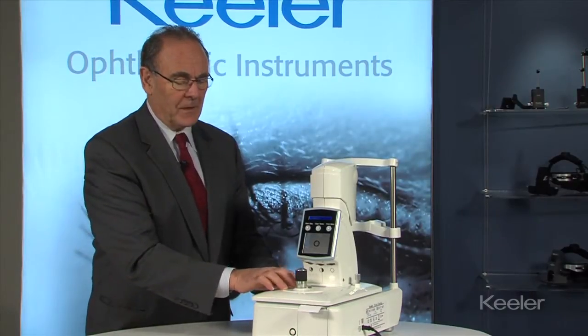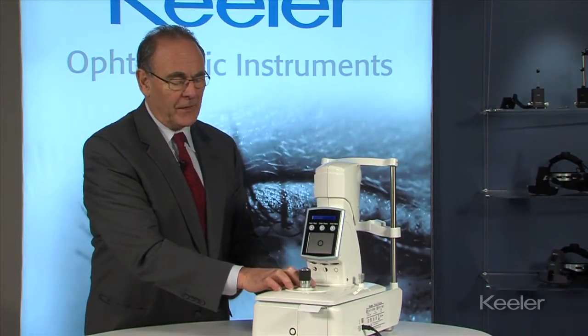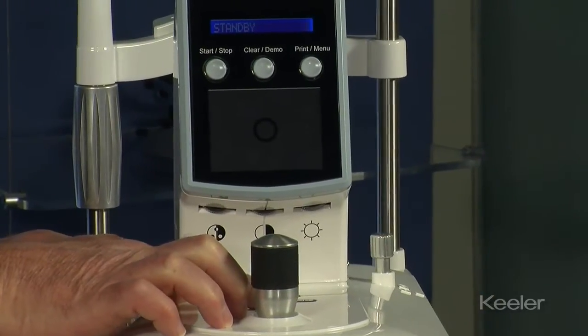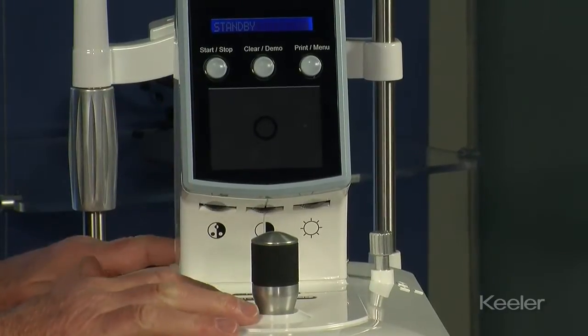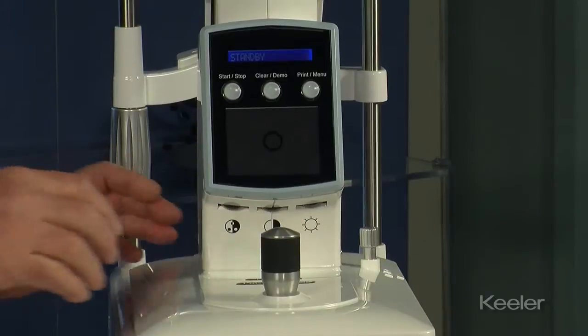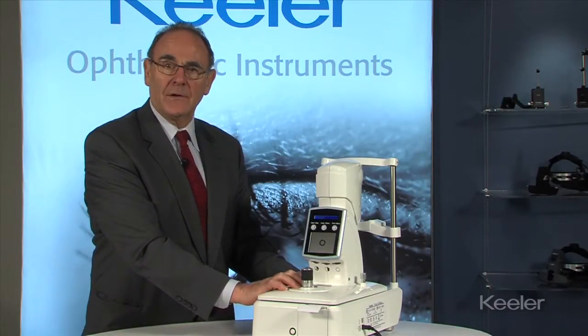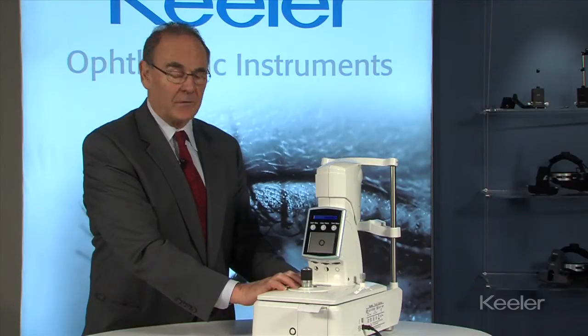On the platform there's an easy pulse button, and if this is pressed then easy pulse will come up on the screen. This opens up the parameters of the instrument so that it will be able to take readings on difficult corneas, such as scarred corneas.